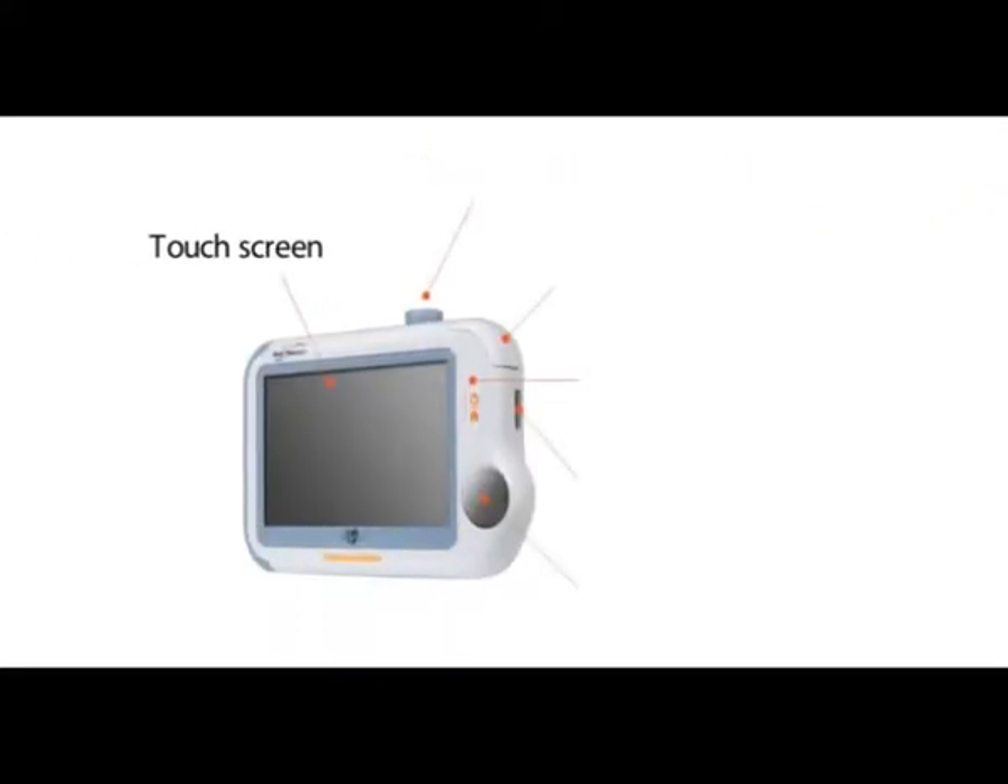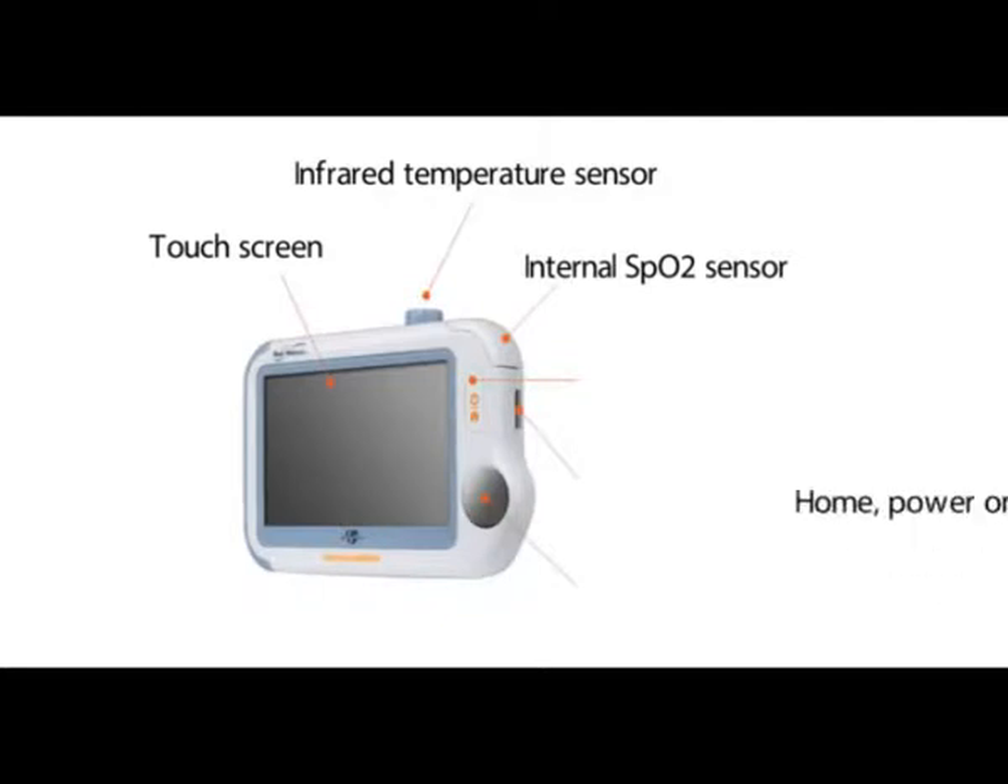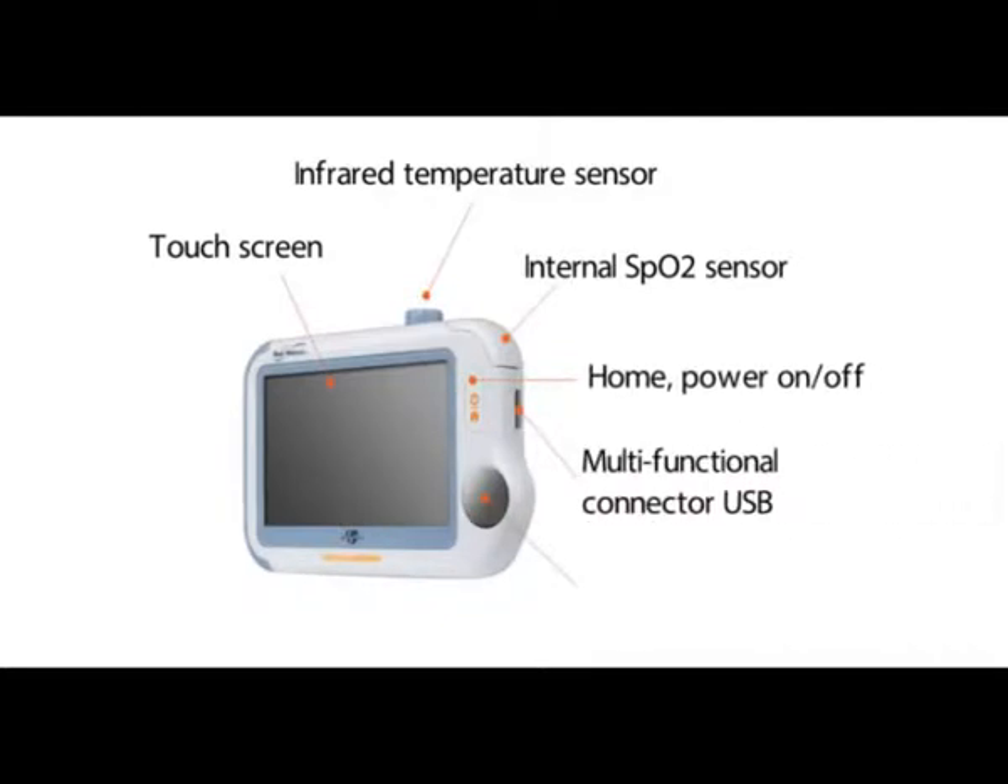On the front: the touch screen, the infrared temperature sensor, the internal SPO2 sensor, the home power on and off button, the multifunctional connector, USB, and the ECG right electrode.